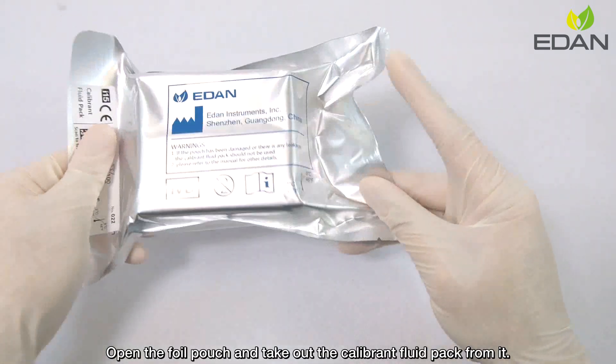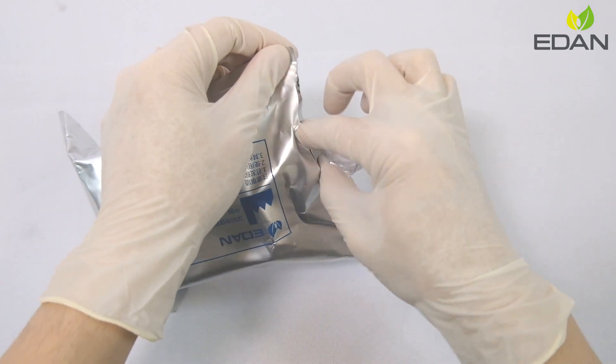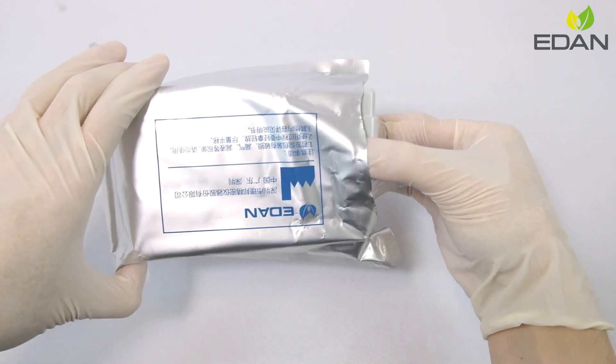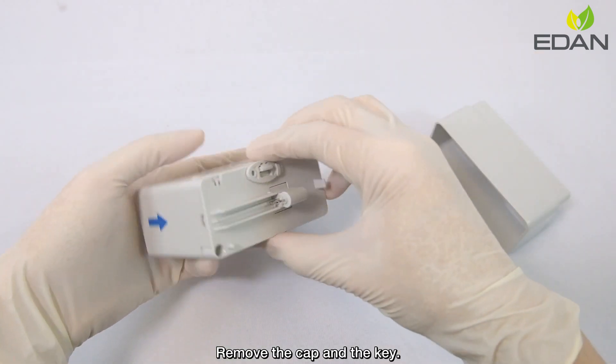Open the foil pouch and take out the calibrant fluid pack from it. Remove the cap and the key.